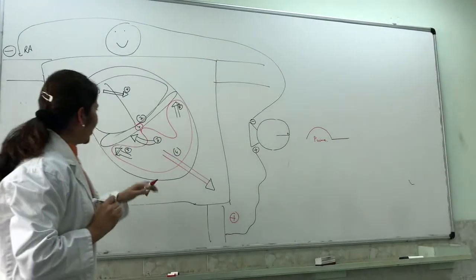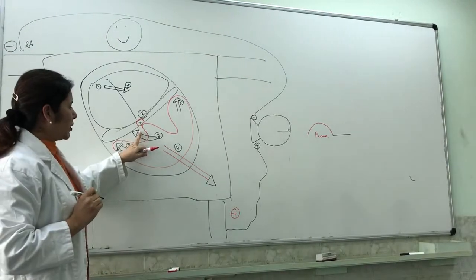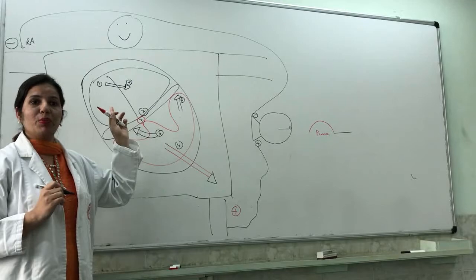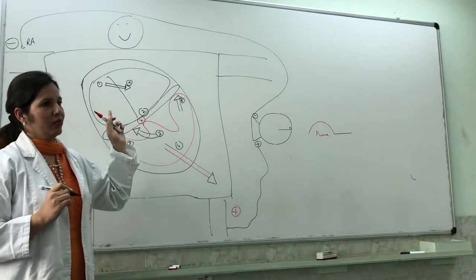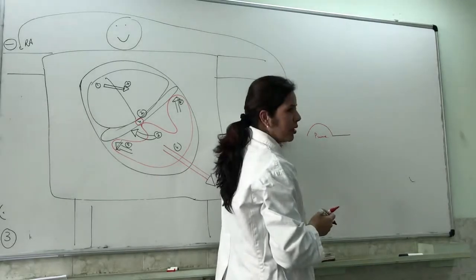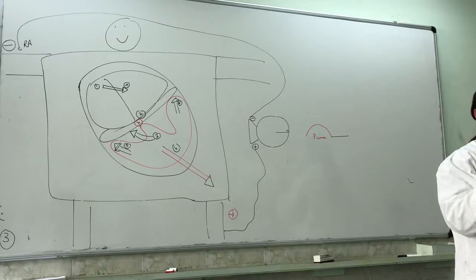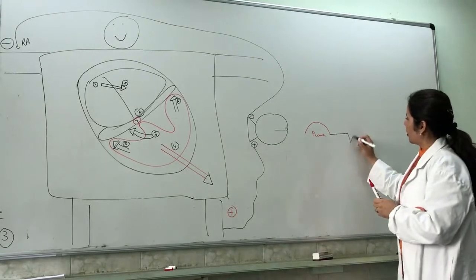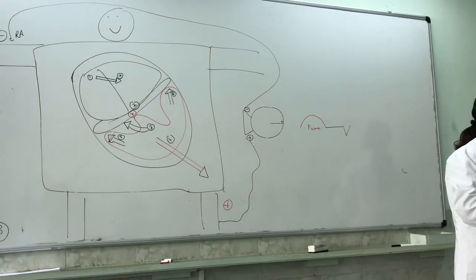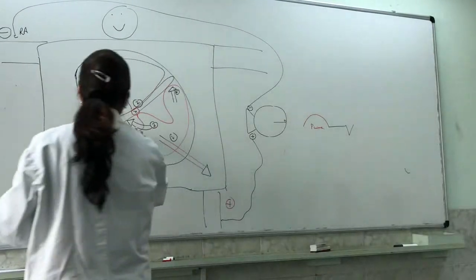Right? The next vector is the septal depolarization. The positive charge is going away from the positive electrode. So it is negative, and the galvanometer will now go down. And it was a good velocity, so it will just be a very quick wave. Right? So here it is going away from the positive electrode.